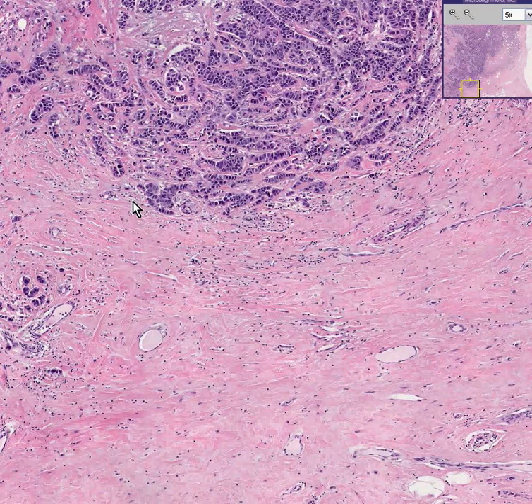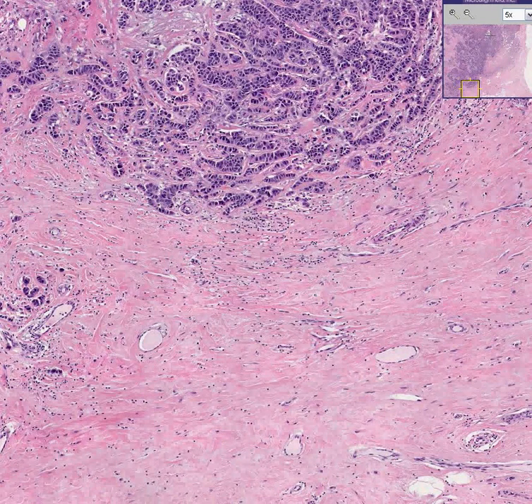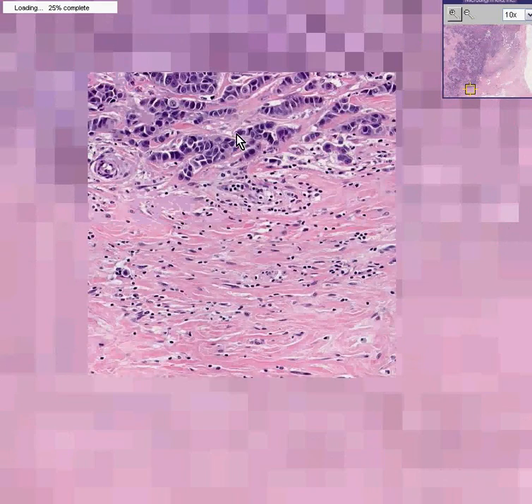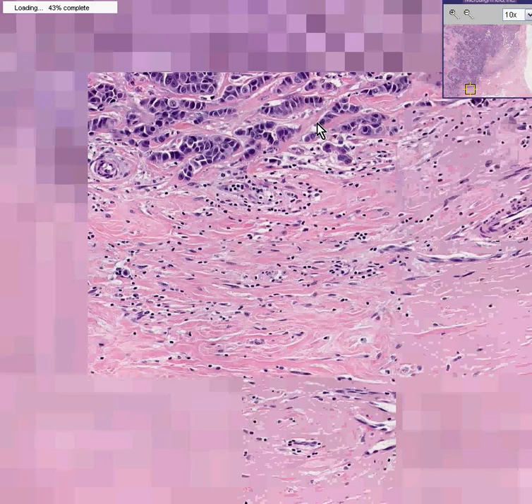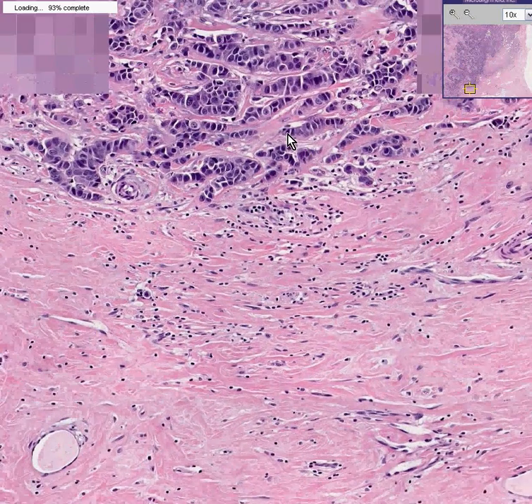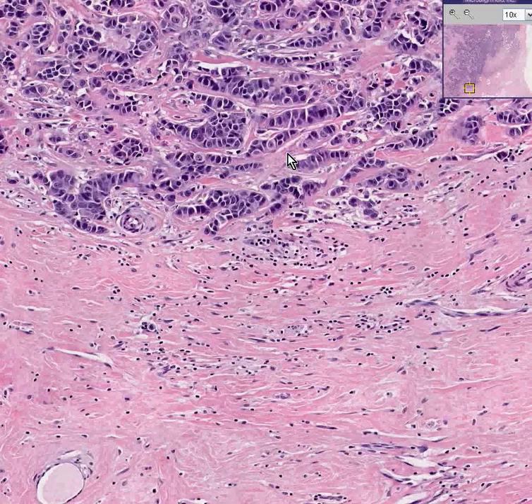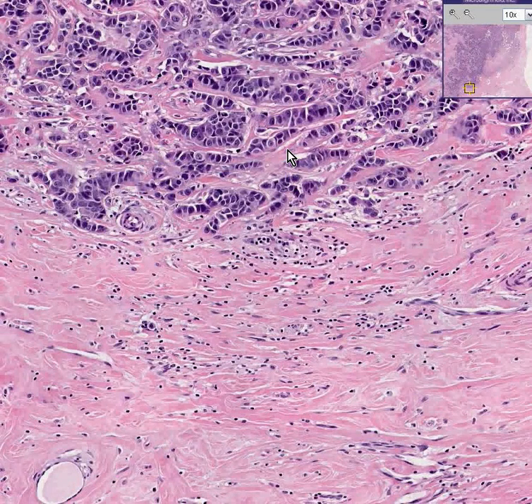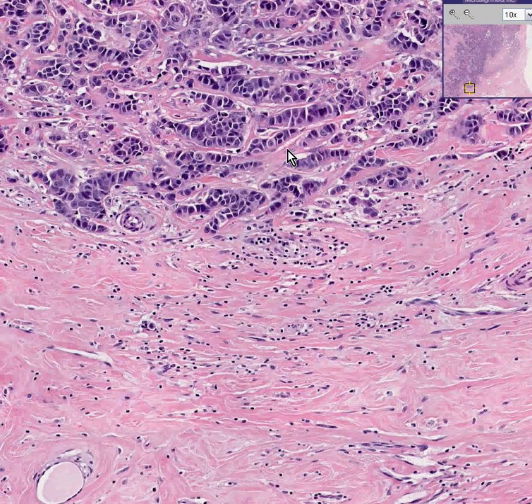Also classically for most breast carcinomas, these infiltrating nests of cells evoke a pretty dense fibrous tissue response. So for that reason, when you cut a breast cancer, you can often hear it because it's gritty. It's also why they give most breast cancers the name scirrhous, because the word scirrhous basically means fibrous.